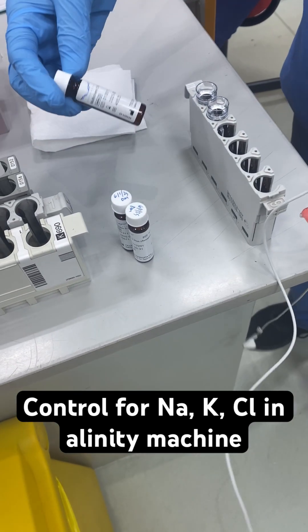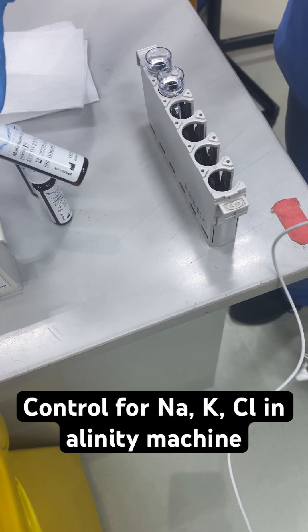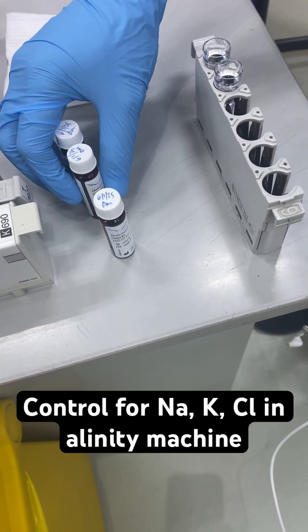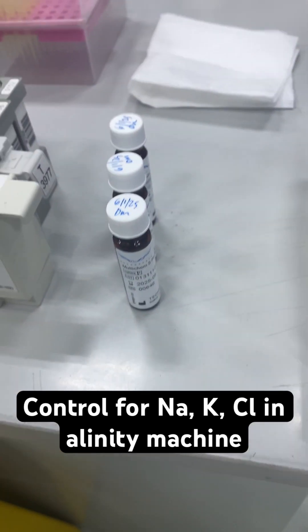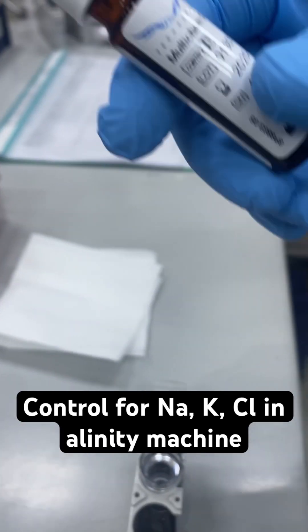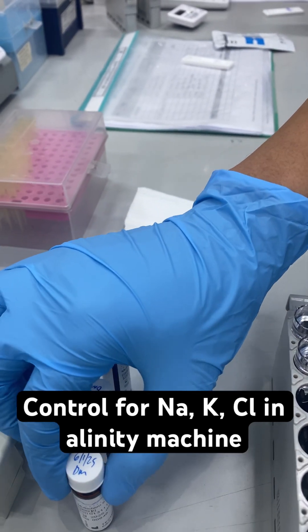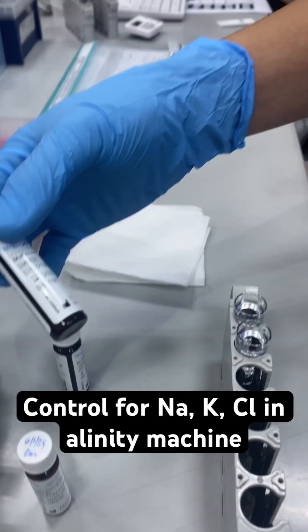Today we are going to run control for sodium, potassium, chloride, and creatinine. For these four tests, we use multi-chem control from TechnoPath. We have three levels, but today we are going to use level 2 and 3.